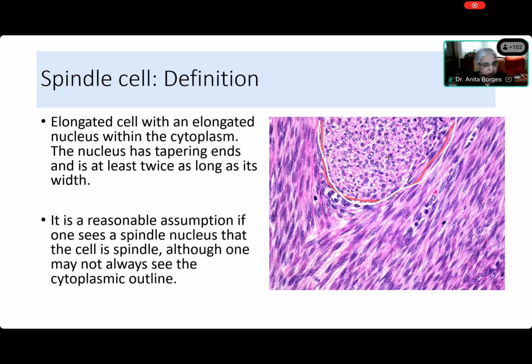Okay. Diksha? Diksha? Are you there, Diksha? No. Diksha has muted herself. No, I muted Diksha and Dipali just to check. Sorry. I'm so sorry. Diksha? Diksha, I muted. Diksha, I'm unmuting you. Yeah. Are these spindle cells, Diksha?